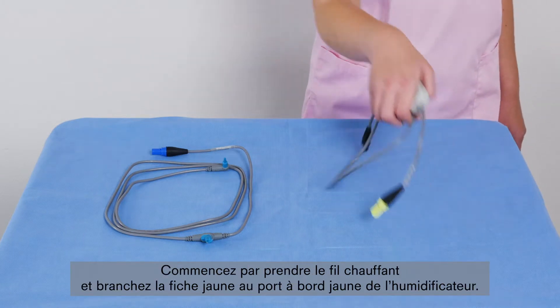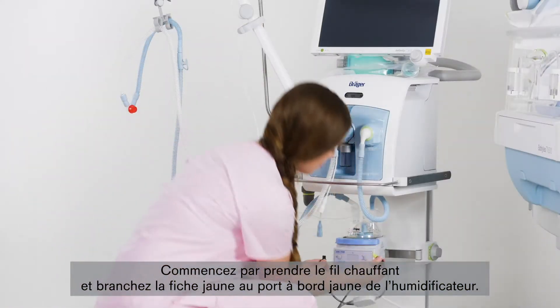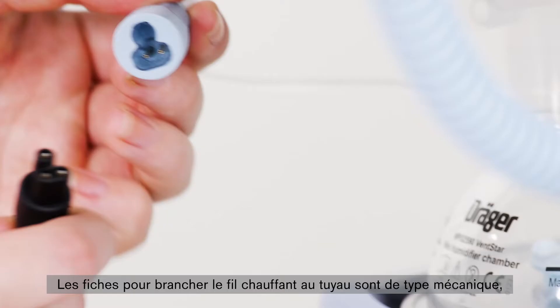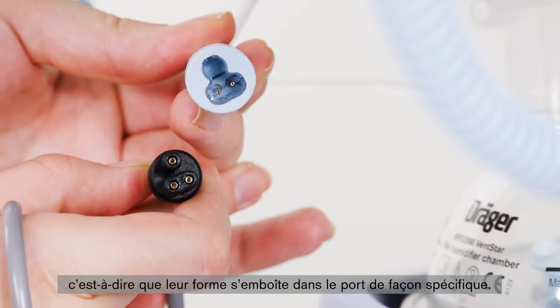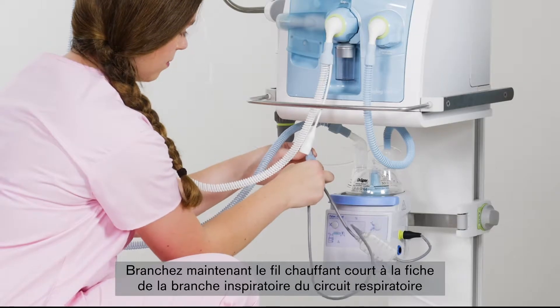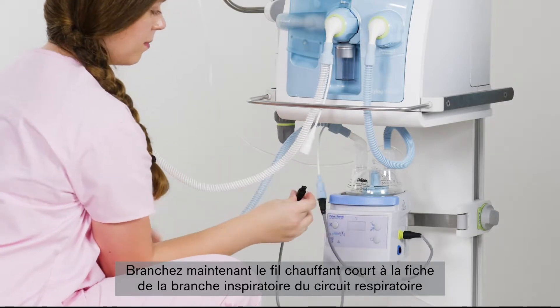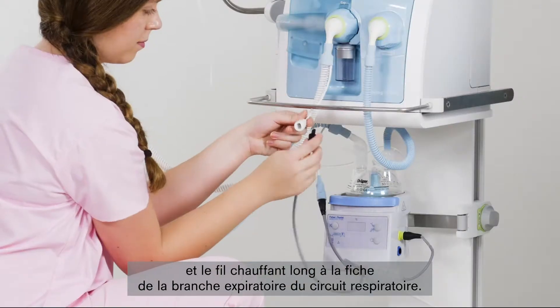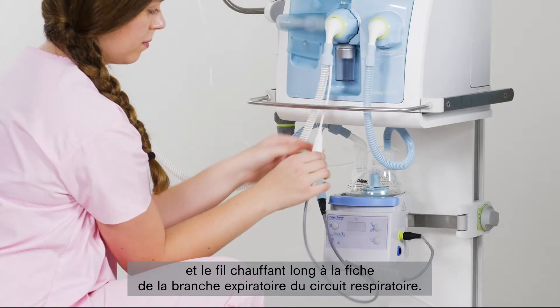First, take the heating cable and connect the yellow plug to the yellow-edged port on the humidifier. The plugs on the heating cable for connection to the hose are mechanically coded, i.e. they have a distinct shape that fits into the connection port. Now connect the shorter heating cable to the connector on the inspiratory limb of the breathing circuit and the longer heating cable to the connector on the expiratory limb of the breathing circuit.